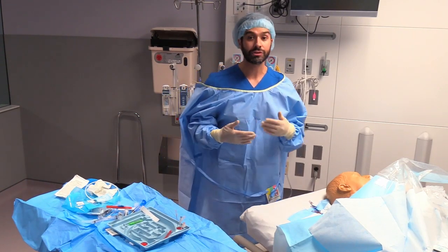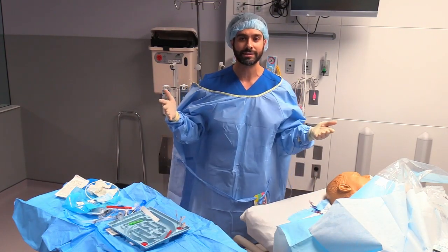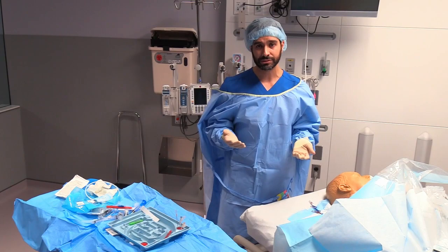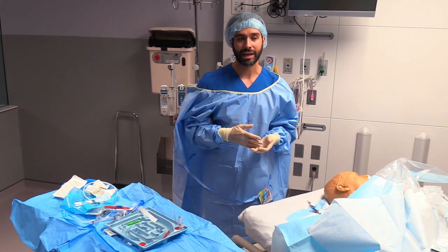Some people, if you want to use it right away, will use ultrasound of the heart and take a look and flush through one of the ports. If all of the bubbles are going on the right side of the heart, it confirms that it's in a venous placement. So that, in an emergency, the patient's on pressors and you can't wait for an x-ray and you don't have other IV access, that would be equally acceptable in terms of identifying the location of the catheter.